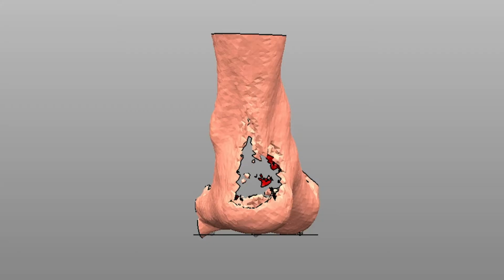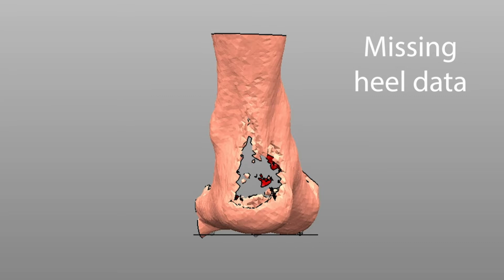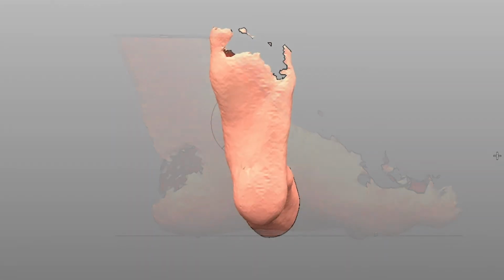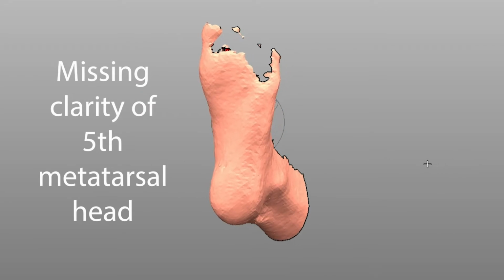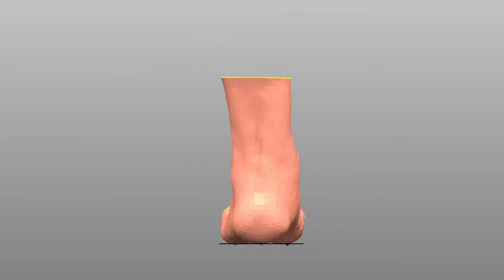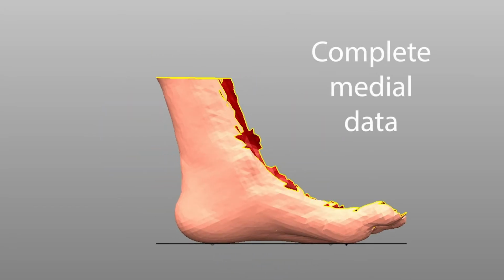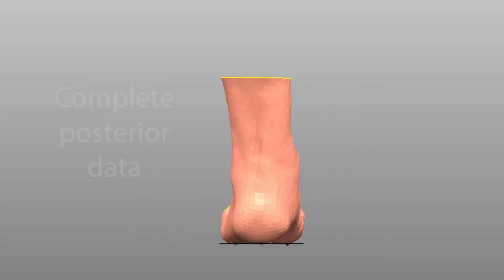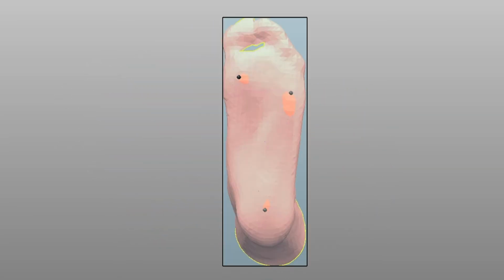Here are some examples of digital casts which have holes or gaps which fail to capture all of the critical anatomy for manufacture of a Richie brace. Here is a proper digital cast, which captures all of the essential anatomy so that a proper Richie brace can be manufactured.